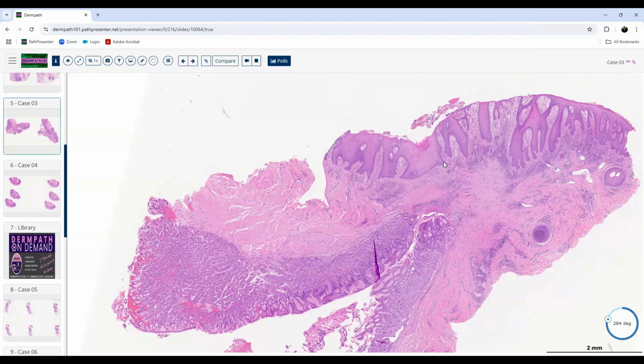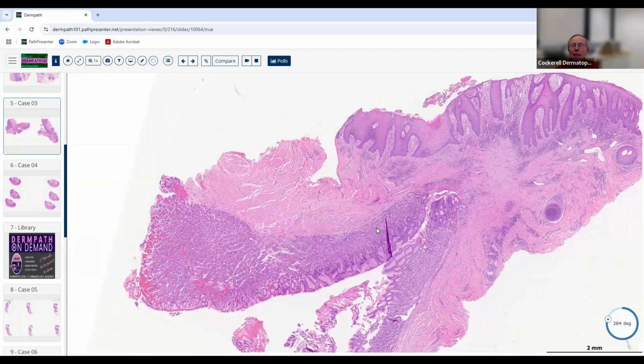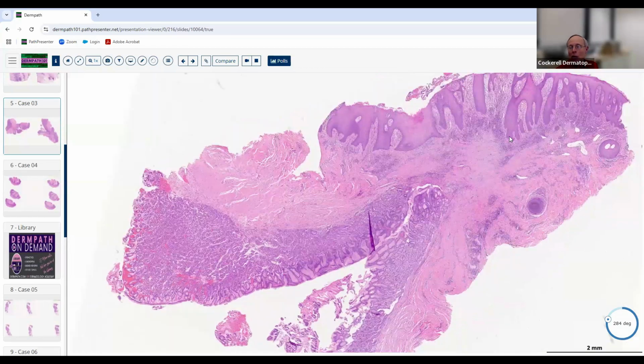And then you mentioned something like an ostomy. Yes, you often get mucosal epithelium that grows into the stratified squamous epithelium from the ostomy site. So it colonizes, it moves into it, just kind of like a Barrett's esophagus. Well, it does that in the skin also. Sometimes you'll see rests of mucosal epithelium in the mouth, in the oral mucosa. But this was in the umbilicus area.